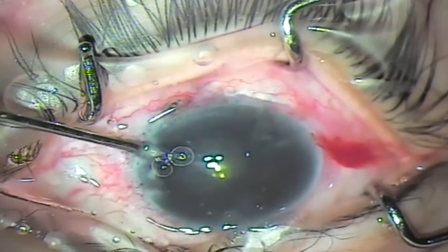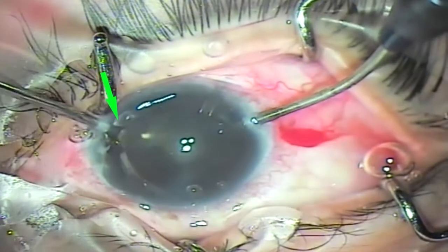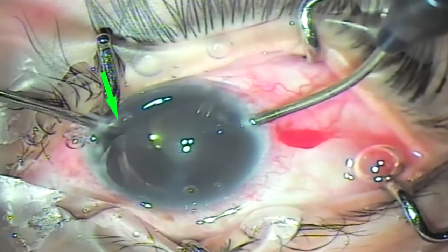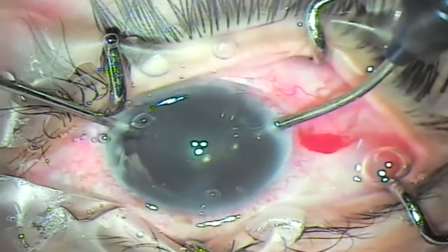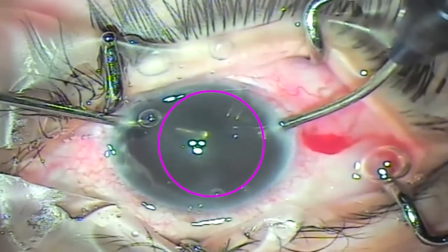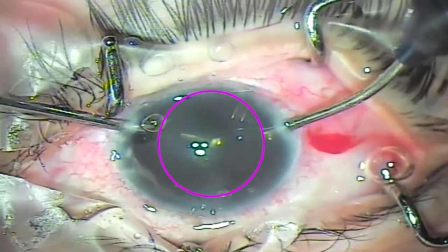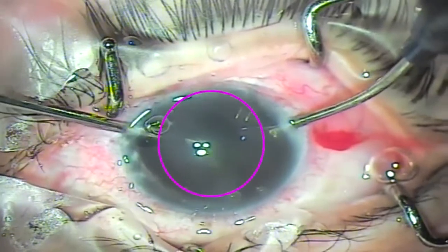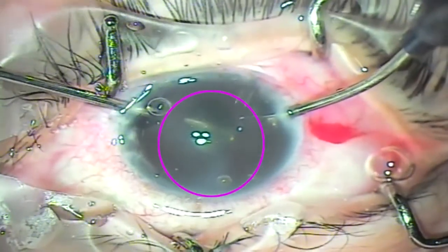Here, the vitreous cutter was first used to excise the pupillary membrane. It is then introduced almost vertically downwards via the surgical iridectomy, with the cutter facing the surgeon posteriorly. Once the zonules are adequately cut, the face of the vitreous cutter is slowly rotated anteriorly, all the while cutting anterior vitreous until it is visible behind the posterior capsule.